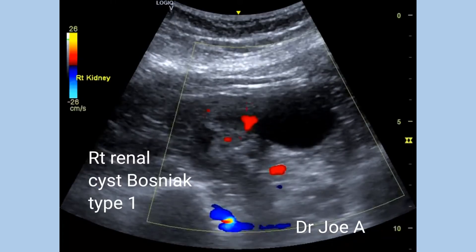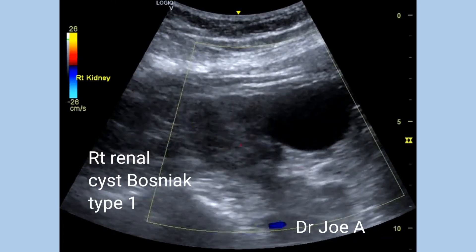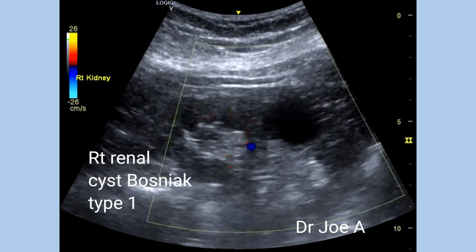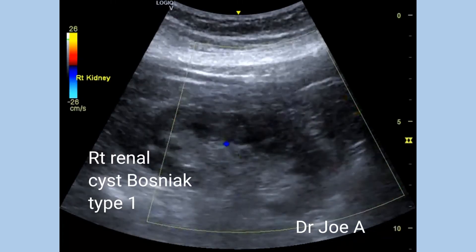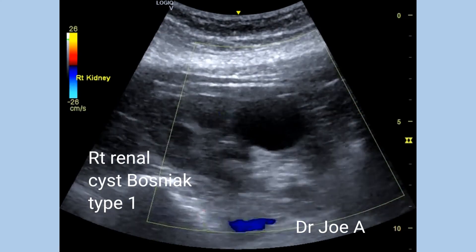The right kidney shows a Bosniak type 1 simple renal cortical cyst.